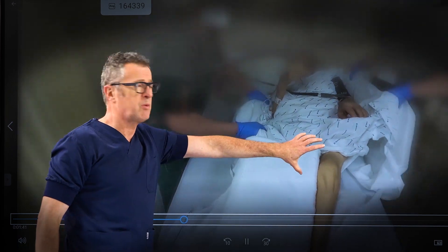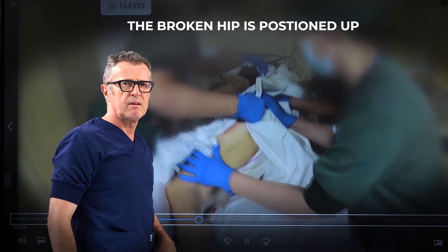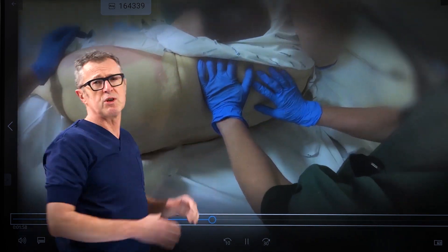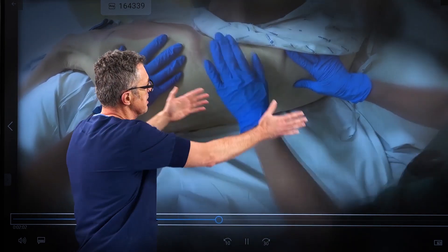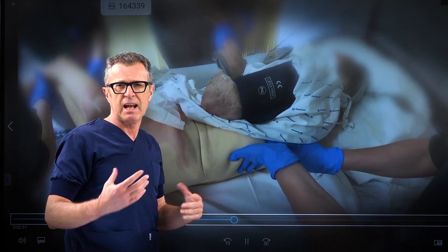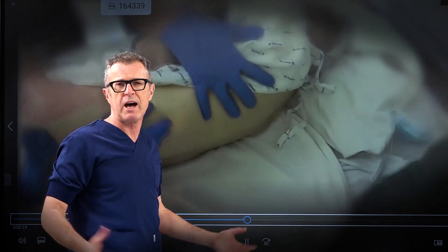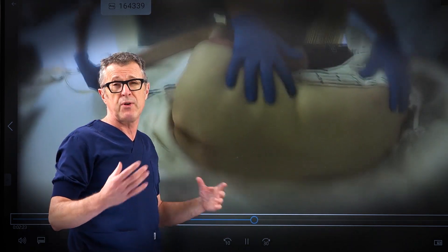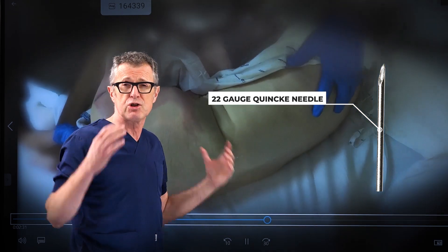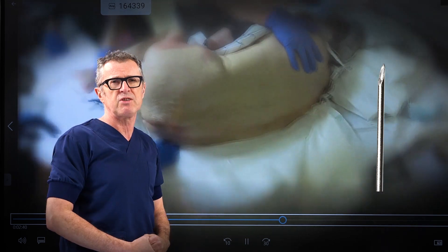This is a right hip fracture, so we performed the right suprainguinal fascia iliaca block and now position the patient laterally, bringing them close to the edge of the bed — this is critical, as a patient positioned too far away makes the spinal very difficult to perform. Most patients in our practice receive a paramedial approach to spinal anesthesia. In this age group, we do not need 25, 26, or 27 gauge spinal needles, which are very difficult to use due to osteophytes and poor anatomy, and there is no risk of post-dural puncture headache.